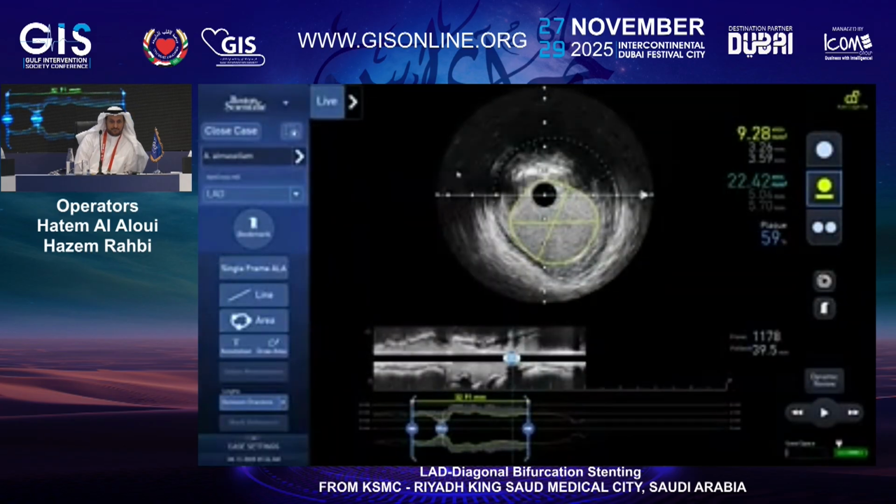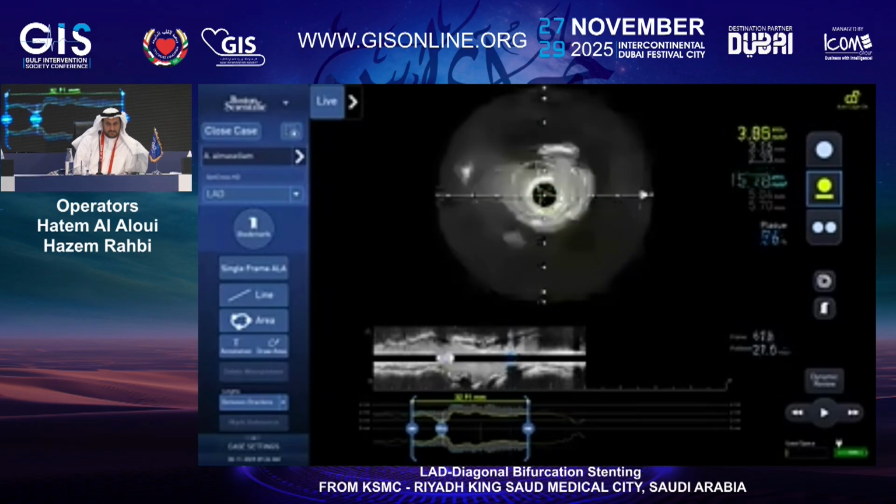So this is, as said, we did this using the Avigo Plus system, the latest iteration from Boston. And this is a run of the IVUS in the LAD. You can see there's the new function, which is the automated lesion assessment. So if I can start from distal.